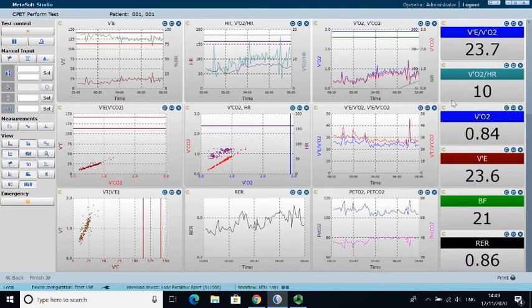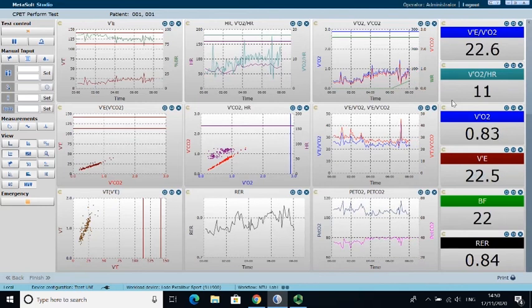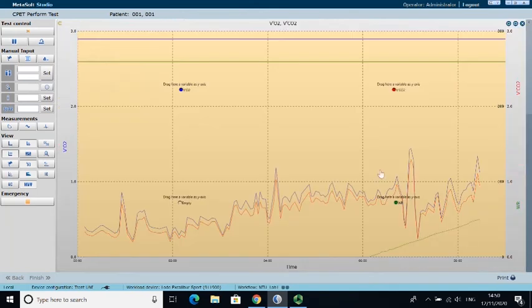From another point of view, if you look at the RER, which is the bottom middle chart, you'll see that RER at rest is sitting at about 0.8 to 0.9, which is normal during rest and unloaded cycling. So in moderate intensity exercise, you can use RER to give you an indication of substrate utilization, and that's indicating that substrate utilization is pretty much 50-50 between fats and carbohydrates. As we go through the test and it becomes more intense, then those calculations go out the window a little bit.